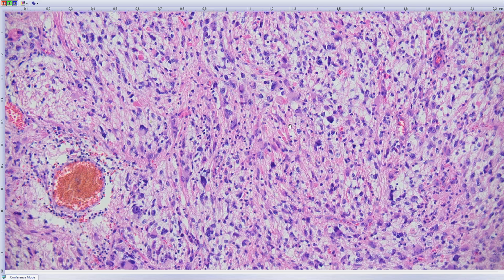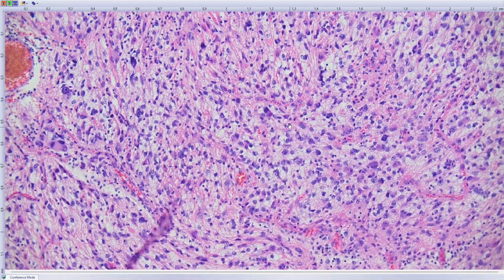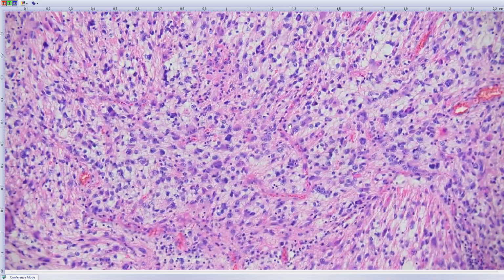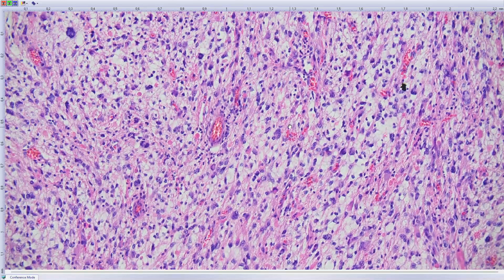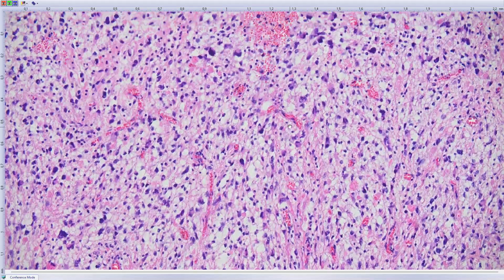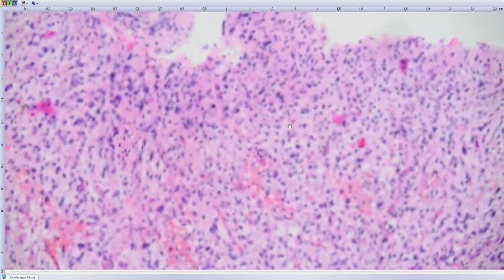but this does not define so-called anaplastic pilocytic astrocytomas. We have to search for mitotic figures, which is very difficult if you have such bizarre nuclei like here. So we have performed. Oh, I will show you another stain.